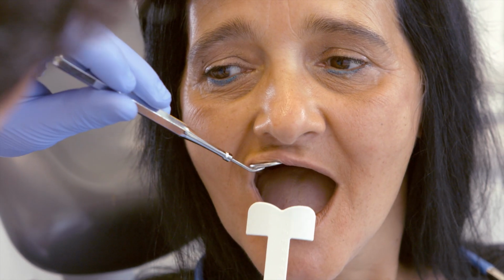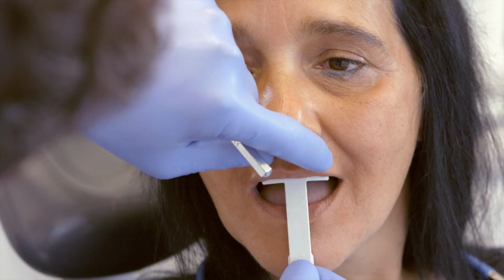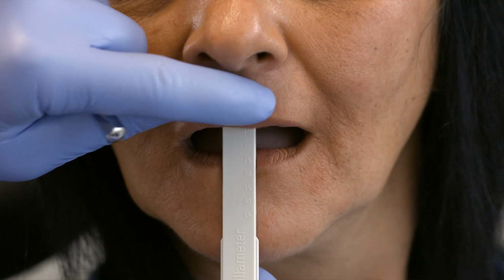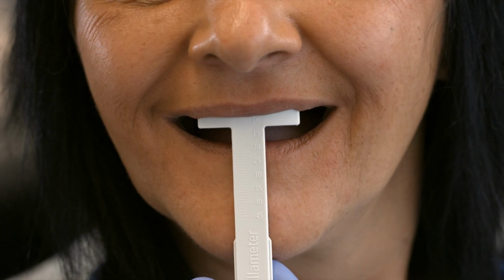Position the papillometer on the papilla incisiva and then determine the length of the patient's lips, first when the upper lip is relaxed, and then when the patient smiles. This value allows you to draw conclusions regarding the length of the anterior teeth.